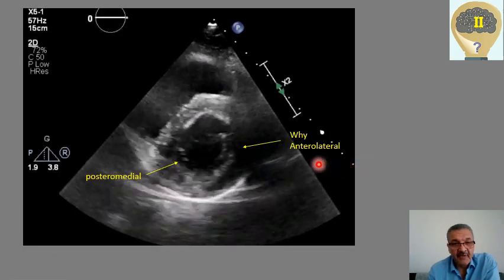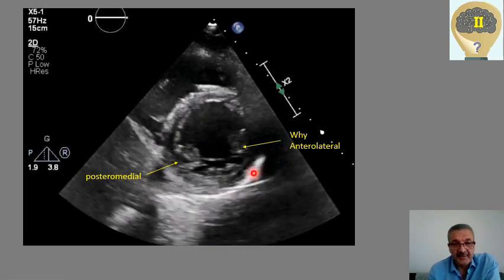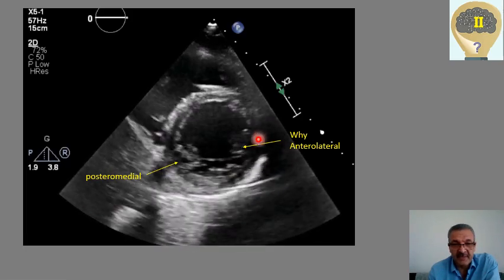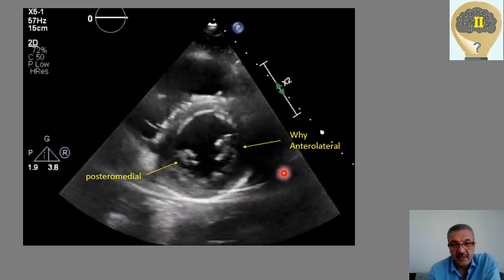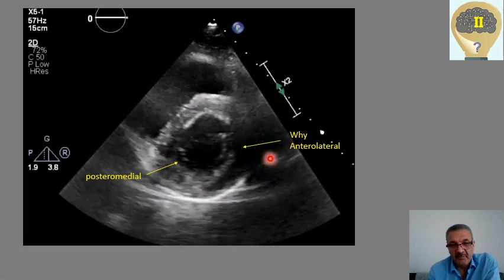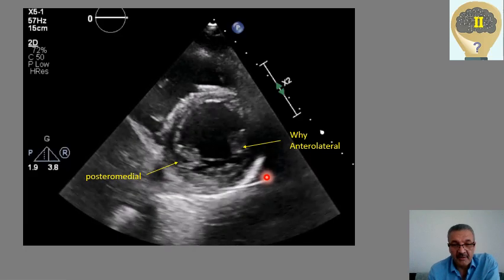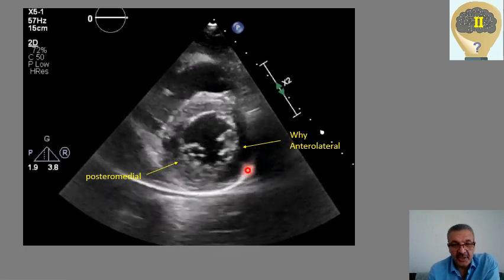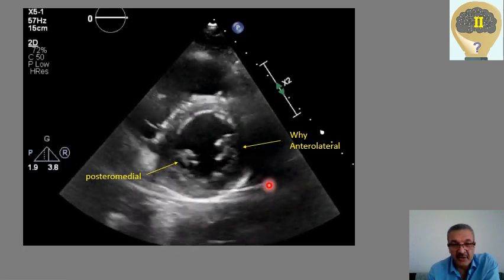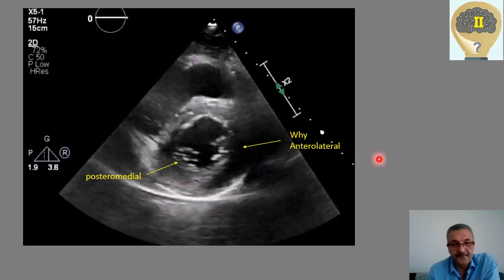Here we have a subcostal external short axis, short axis view at the level of the papillary muscles. As you know, there are two papillary muscles — anterolateral and posteromedial. If you look at the image and put a line here, both of them appear posterior. So why do we call one of them anterolateral? And second, does the location of those papillary muscles in the image correspond with their real anatomy and the names we call them in echo — or not? And why?